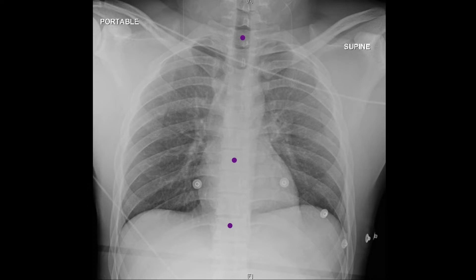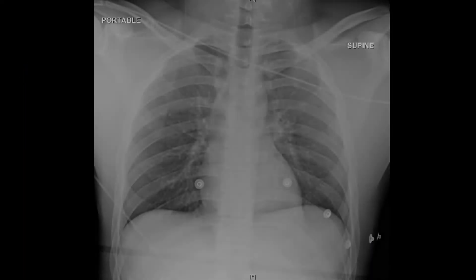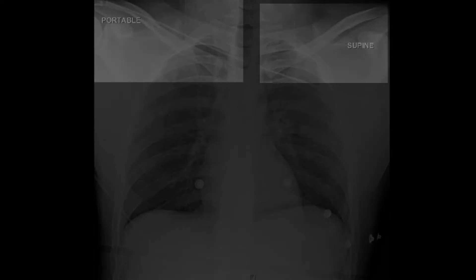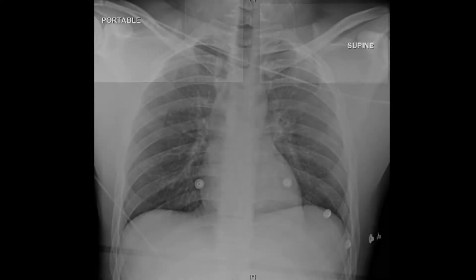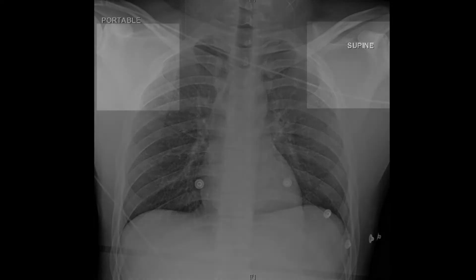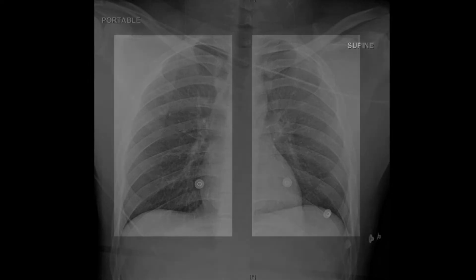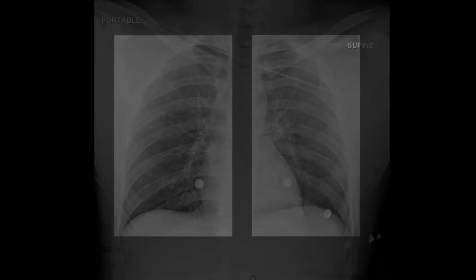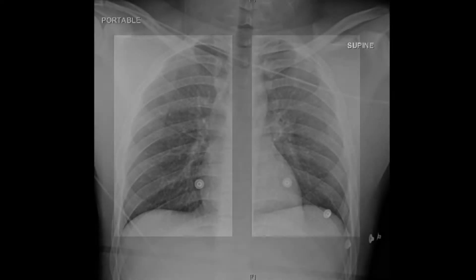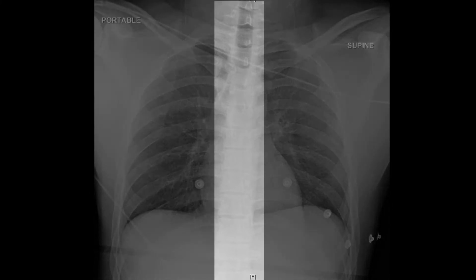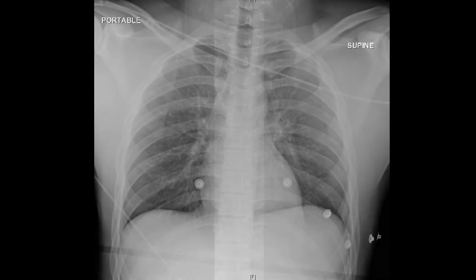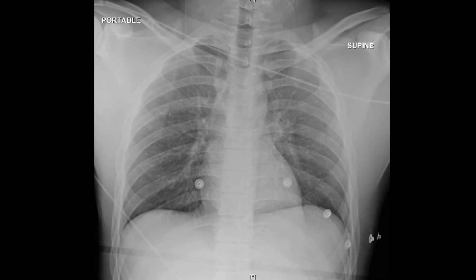This chest x-ray is overpenetrated. Now let's go on to B for Bones. Do a circuit — check out the right, then the left clavicle, and make sure you also check out the scapulae on both sides. Trace the ribs all down on both sides, because it's very easy to miss a fracture there. Finally, make sure you check out the spinal column. Crush fractures, even dislocations, have been missed because they just weren't looked for.